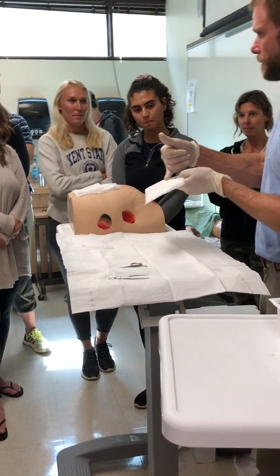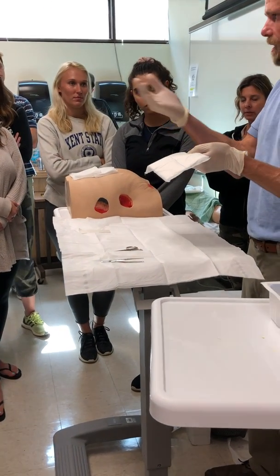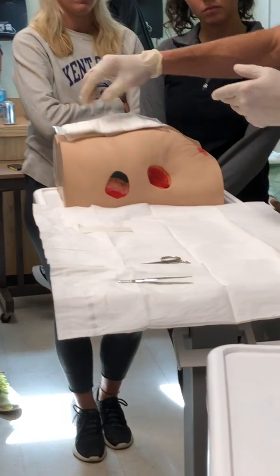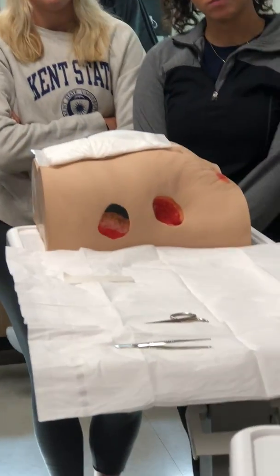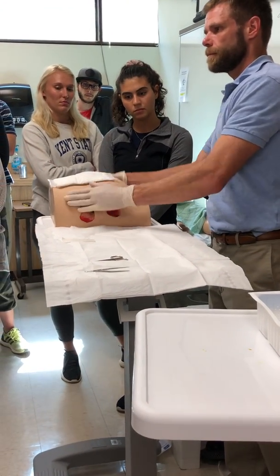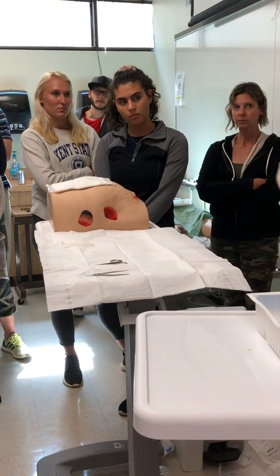So we have the blue line here, right? Like a diaper has a thing that changes color when it's wet. Same idea here, on the outside. My gloves are sterile, right? Yep. Everything is sterile, right? Mm-hmm. I'm being sterile. Don't need to be sterile anymore.